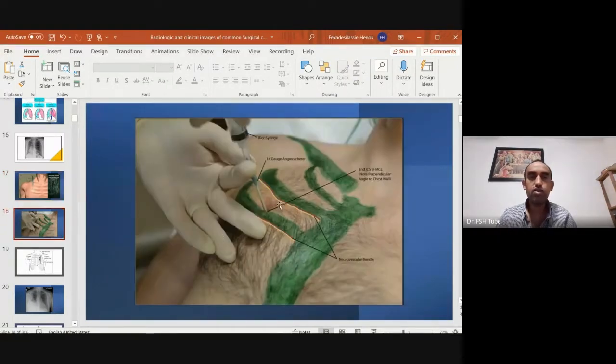Excellent. Here you can see the neurovascular bundle running at the lower border of the rib. Okay, so simple anatomy, anatomy 101. The neurovascular bundle runs under the rib border, so you avoid the lower border of the second rib. You come over the top of the third rib, and you are away from the neurovascular bundle. Here you see the neurovascular bundle, okay?